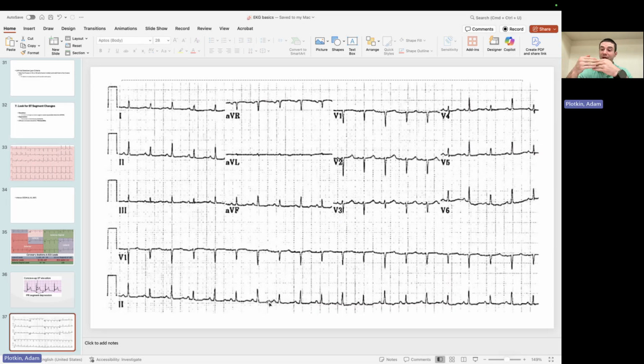I already kind of explained that we have fluid that's blocking the EKG signal from picking it up from the heart. Okay, it's blocking the EKG lead from picking up that electrical activity. But then the heart swings back the other way, and now you pick up a normal QRS, right? So it's based on the heart swinging through this effusion. When it gets really close to the effusion, it's hard to pick up that signal. When it swings away from the effusion, it's easier to pick up the normal QRS.